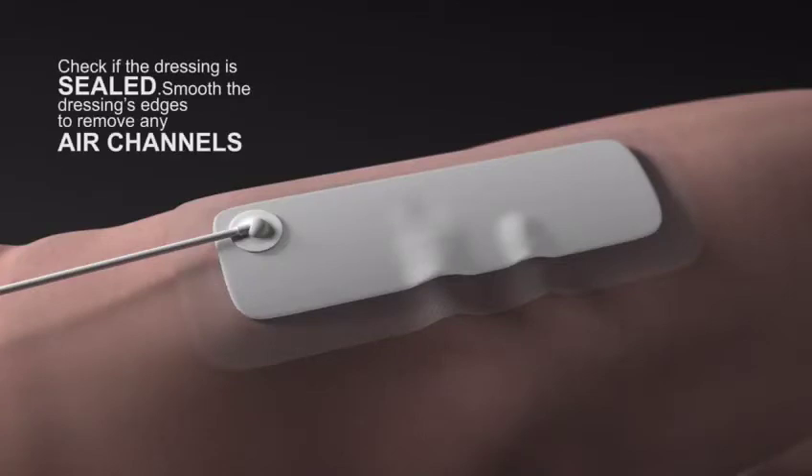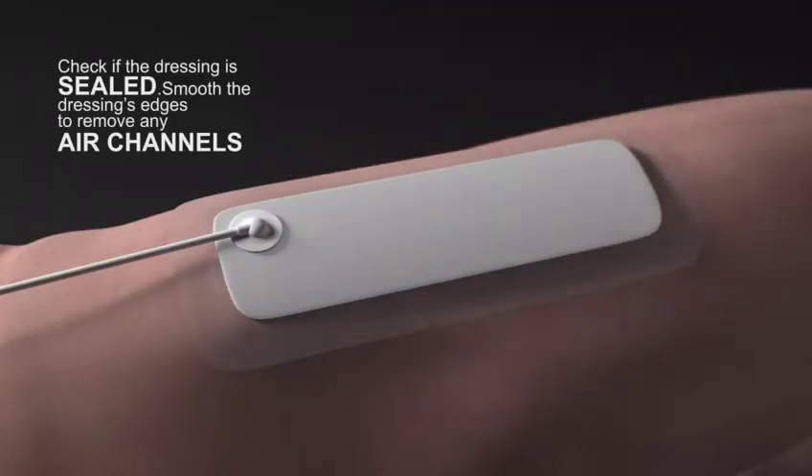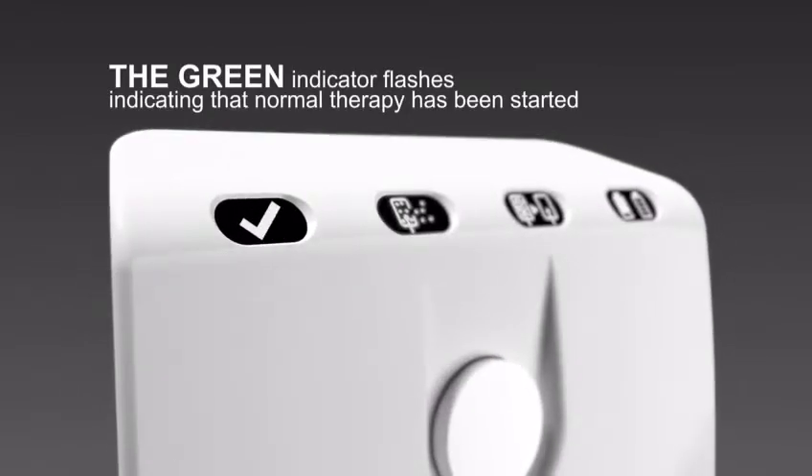Check if the dressing is sealed. Smooth the dressing's edges to remove any air channels. The green indicator flashes, indicating that normal therapy has been started.